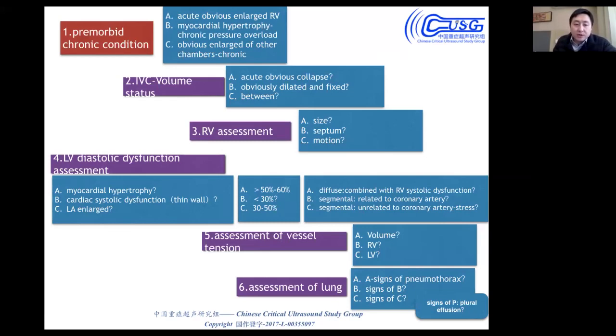And the fourth step will assess the left ventricle, to see if there's an enlarged left atrium, how the cardiac systolic dysfunction is, or if the patient has myocardial hypertrophy, and will assess the degree of the dysfunction of the left ventricle by eyeballing to distinguish the different degrees of dysfunction.